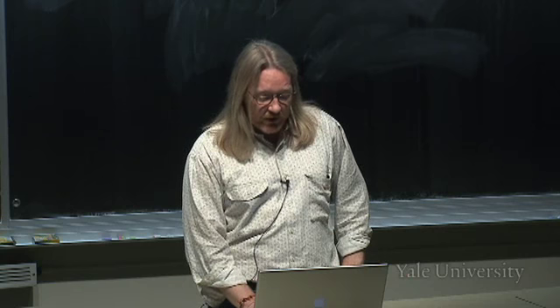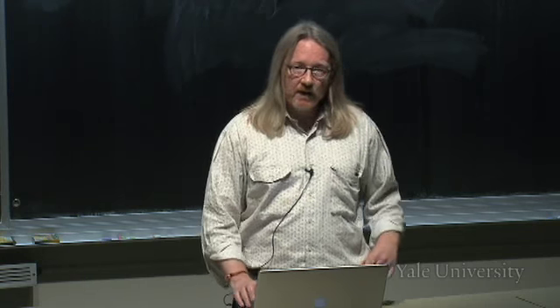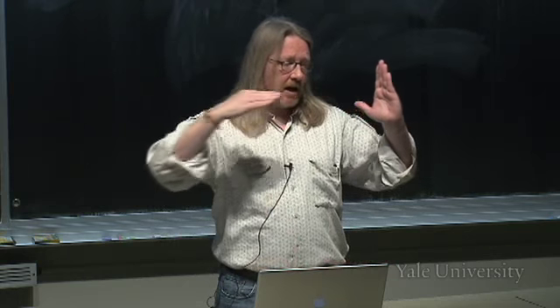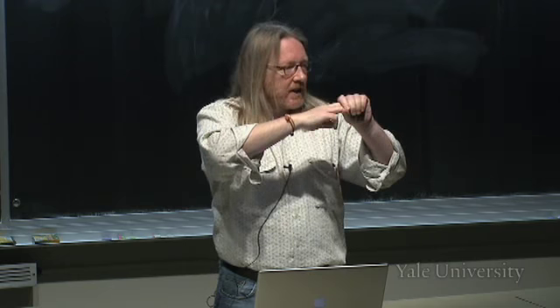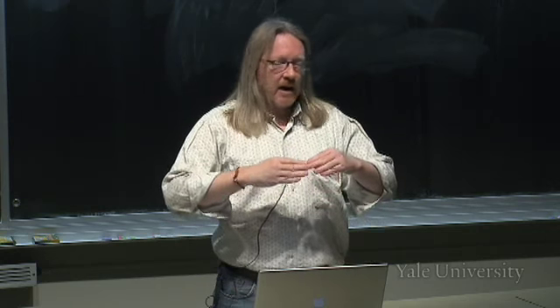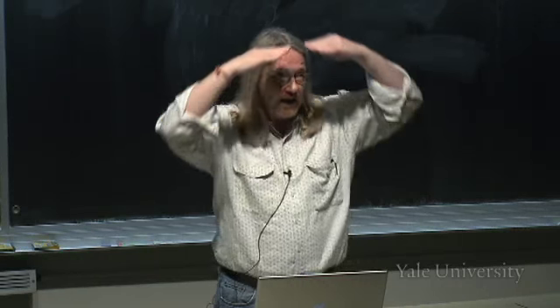So this is some examples of MR images. These are MR images that are taken at different locations in the brain. And remember now that the patient is being conveyed on this table into the core of the instrument. And measurements are made only on the part of the body that's inside the instrument. And so just like in CT imaging, you move the patient through and you take images of different slices through the patient. Now, if the patient is having a brain or a head MR scan, you would just put them in until you went through this part of the body.